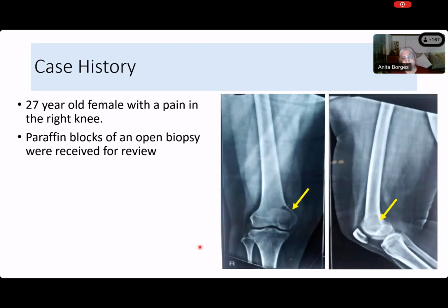As the X-ray picture shows, this is the... Now you know how to describe, Prayas. Yes, the X-ray picture shows the epiphyseal end of the femur. The what end of the femur? What end of the femur is this? Upper end, lower end?